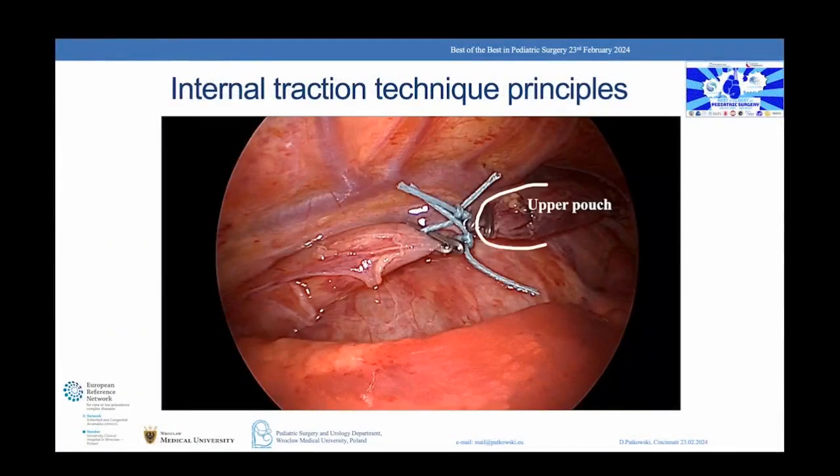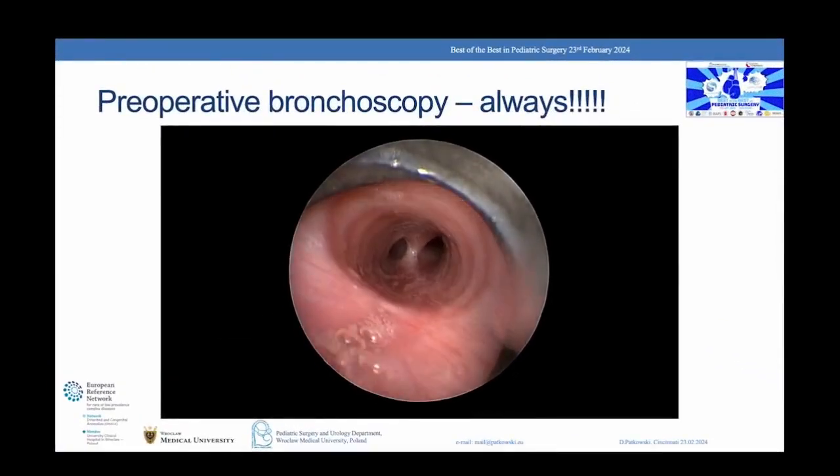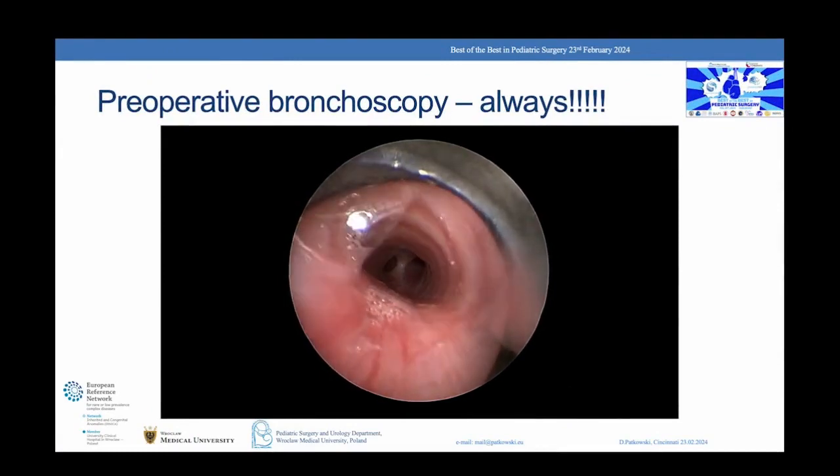Both ends of the esophagus are brought together under tension with an internal traction suture. This is a static, not active tension. The preoperative rigid bronchoscopy is a standard procedure to check for upper fistula and any tracheal malformation.